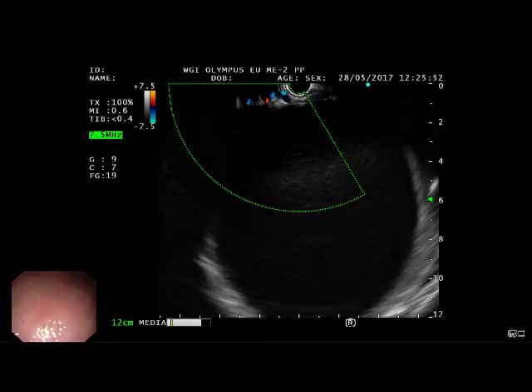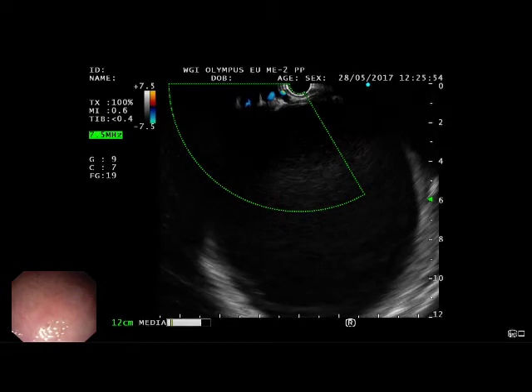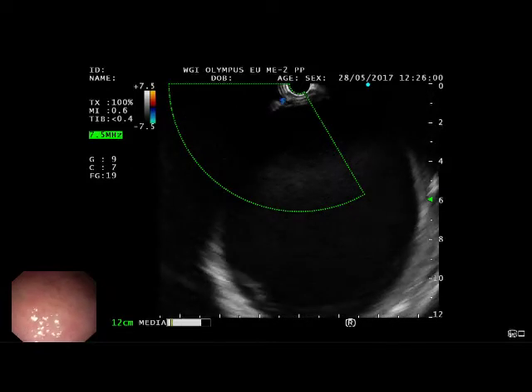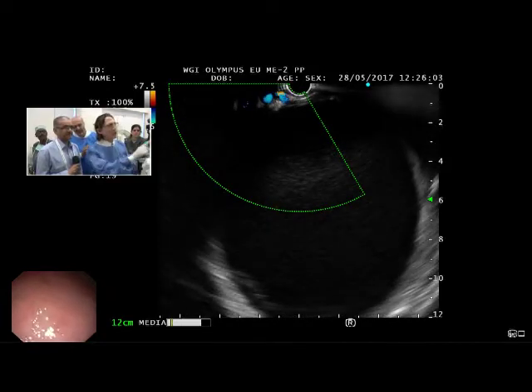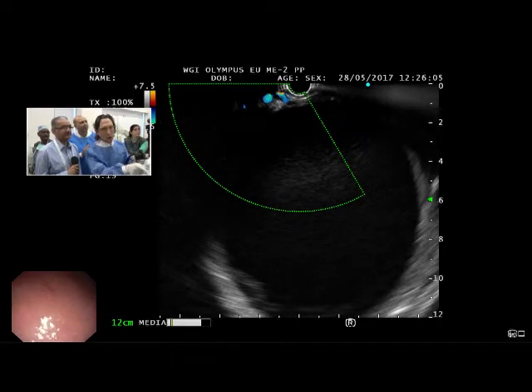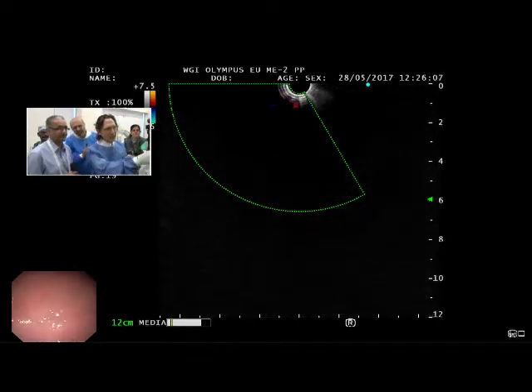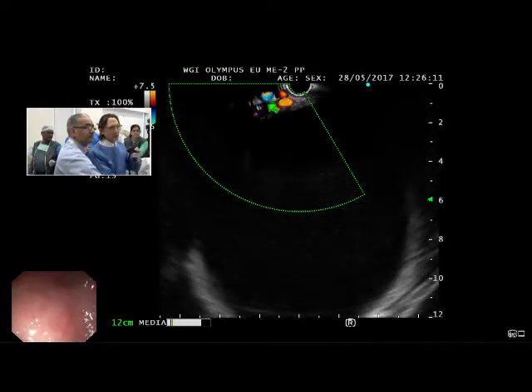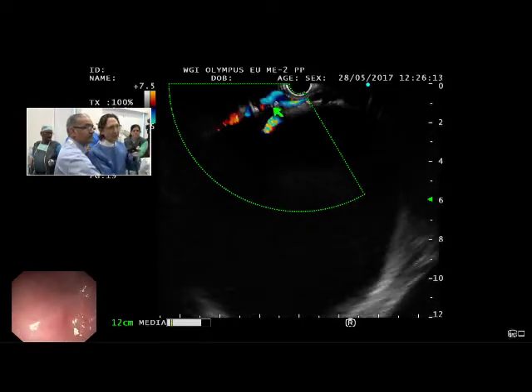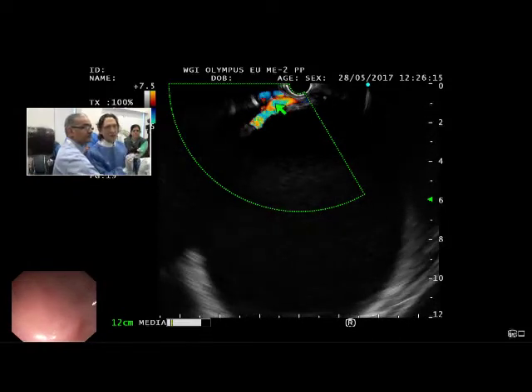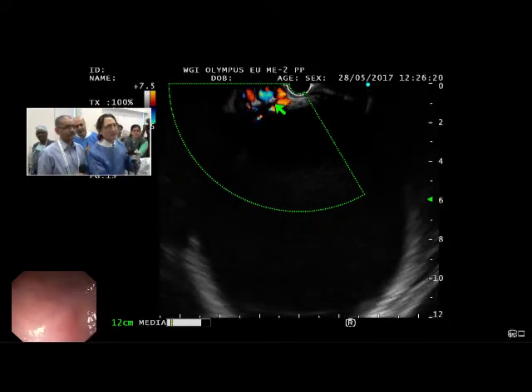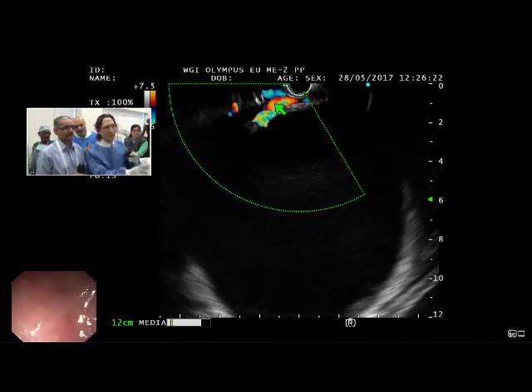I just want to emphasize a few teaching points. I've introduced the therapeutic echo endoscope into the duodenal wall first, and you can see on the EUS image this large pseudocyst. Note at the top when we put the Doppler on, you see that there are a lot of vessels interposed. So if you were to try to puncture this cyst under endoscopic guidance without EUS, it could be disastrous. You can see these large vessels interposed.